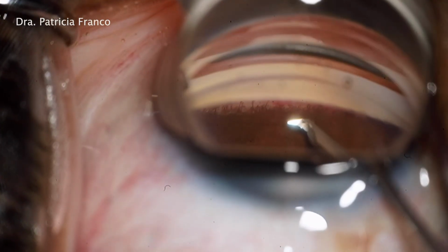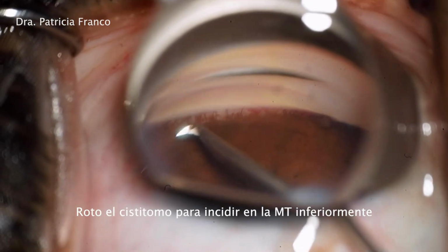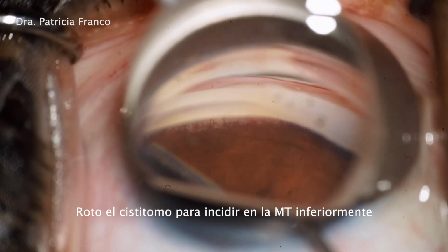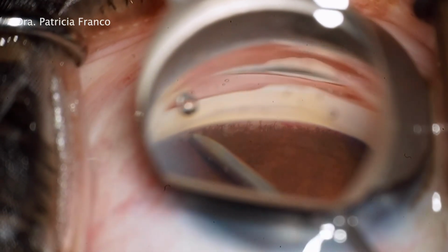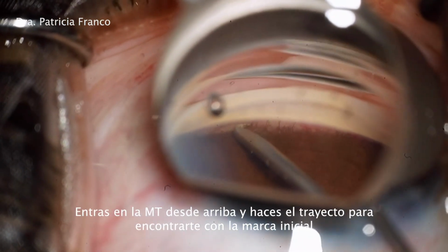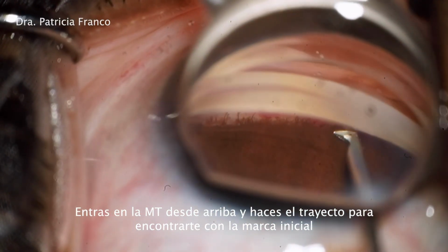I now enter the anterior chamber and I flip the cystotome to enter the trabecular meshwork to start the mark and meet technique. With constant pressure, I pass through it and then I enter the trabecular meshwork superiorly.